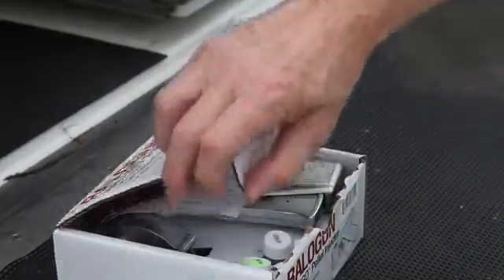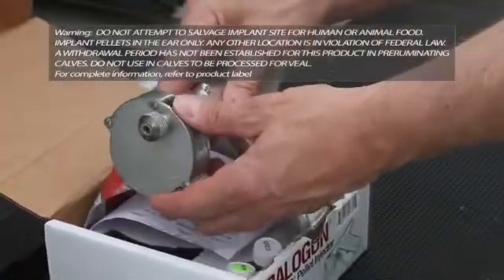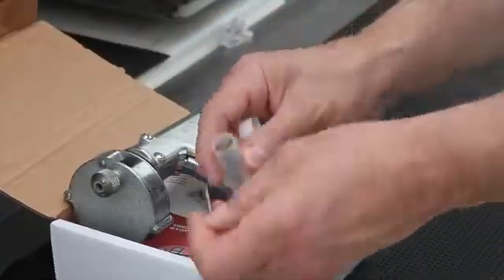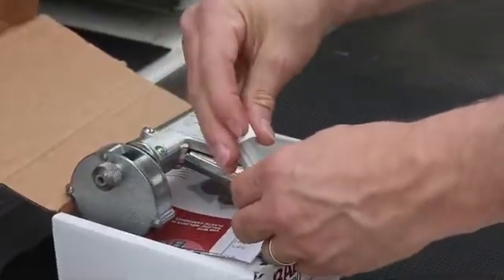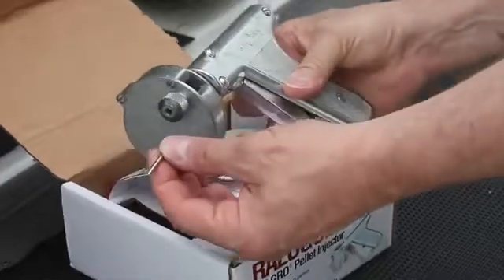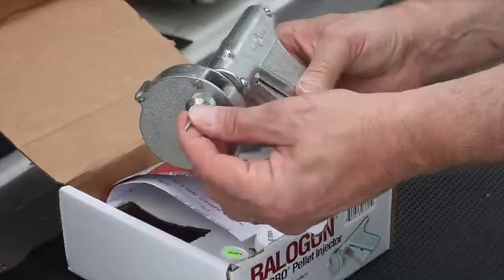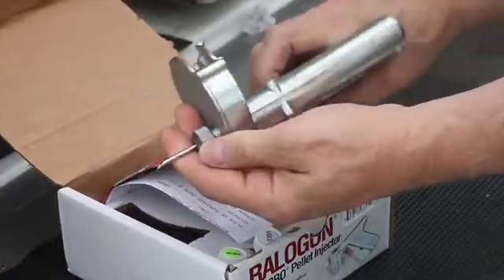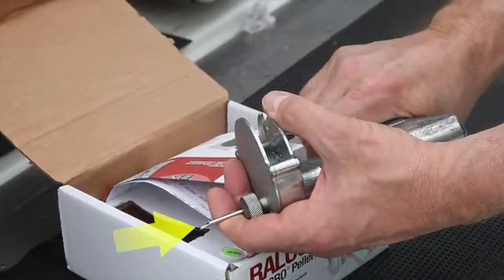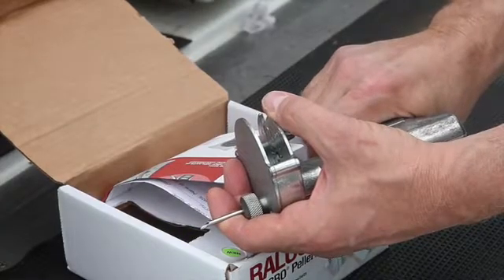Step 1. Place the implant needle in the Rall-O-Gun applicator. Make sure that the implant needle is fully seated in the implant device. Tighten the nut, holding the needle so that the point of the implant needle is on the outer edge of the implant applicator. Failure to seat the needle could cause the last pellet to be left in the applicator needle and not implanted.